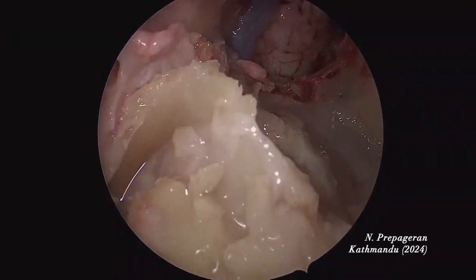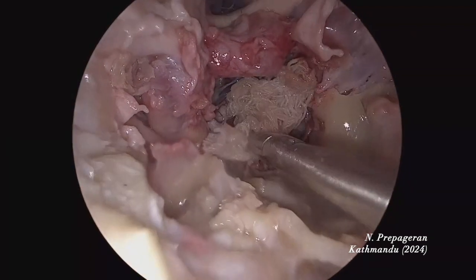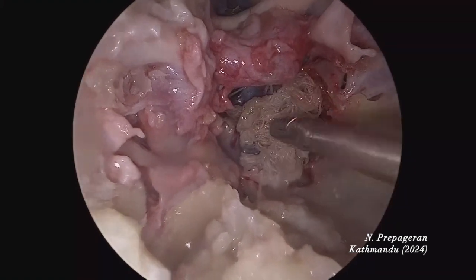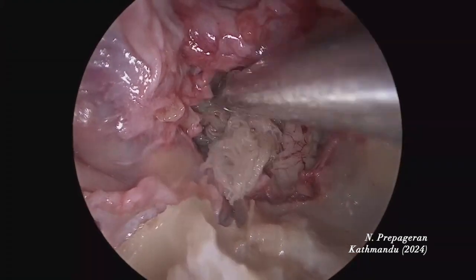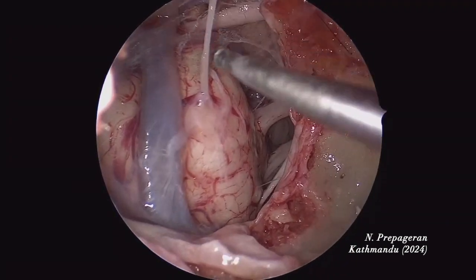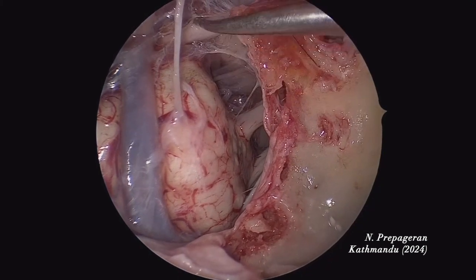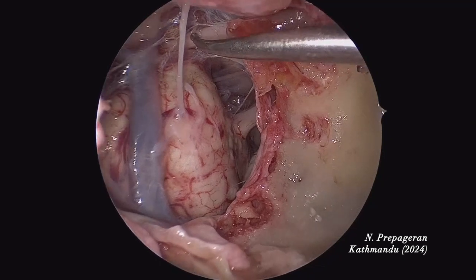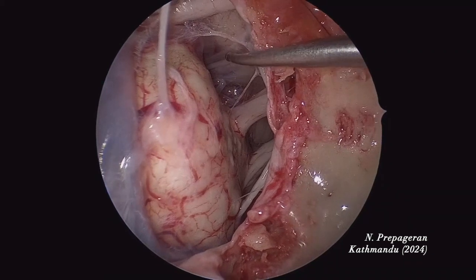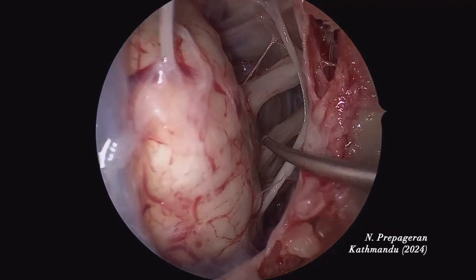How do we reconstruct this? Back to zero-degree scope. Use a piece of fat, put it here, put the dura back, and put the septal flap on top. Basilar artery, posterior cerebral, superior cerebellar, third cranial nerve. Sixth cranial nerve, fourth cranial nerve, fifth cranial nerve — the big one. I'm going to go in now. Seven and eight. Six is close by. Seven, eight, and IAM.